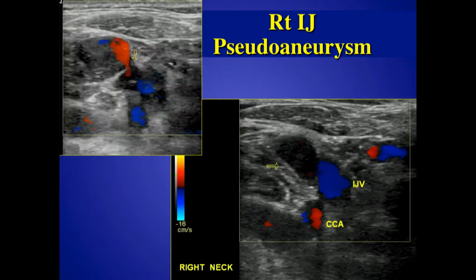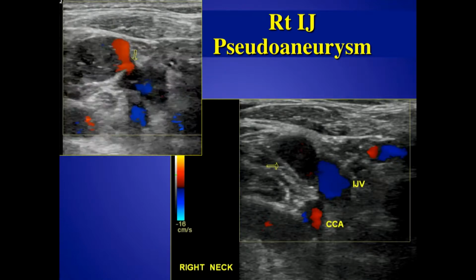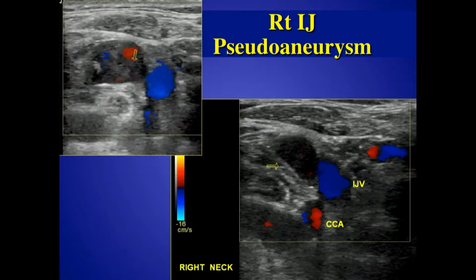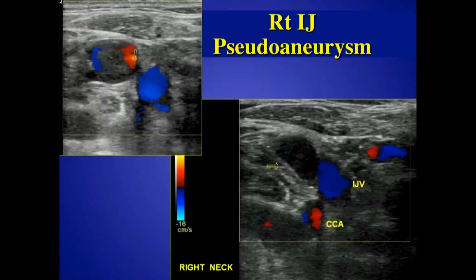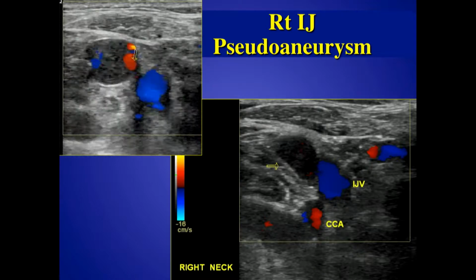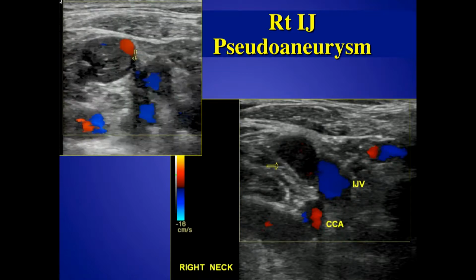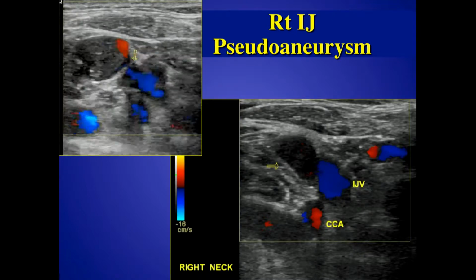It's not so common to see venous pseudoaneurysms, but they can occur. On occasion, we do see venous aneurysms or dilatations, and you can see leaks of the vein. And in this particular case, because it's not an arterial pseudoaneurysm, you could take a more conservative treatment and follow it to see if it closes on its own. If not, then you may consider intervention like a stent.